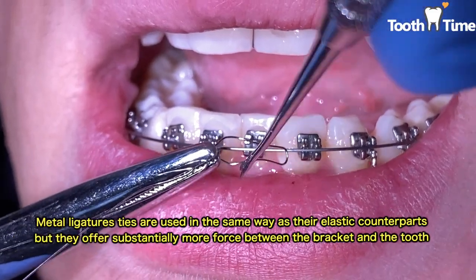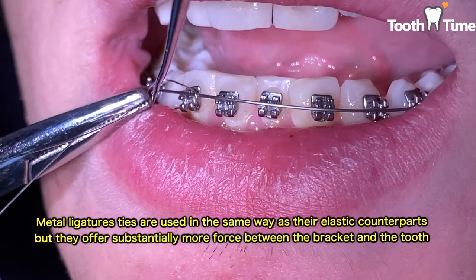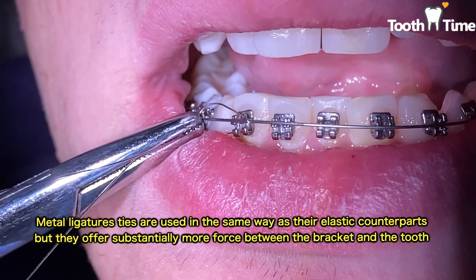And I tightened it with our ligatures, and the ligatures is to help kind of tighten the wire to the bracket to help get really good engagement to help align the teeth really well.